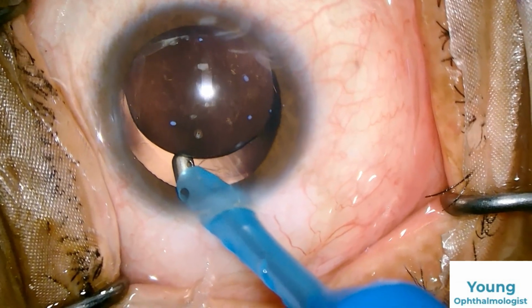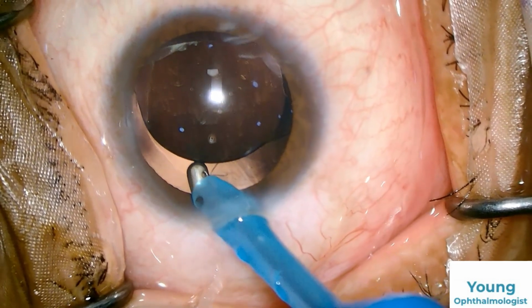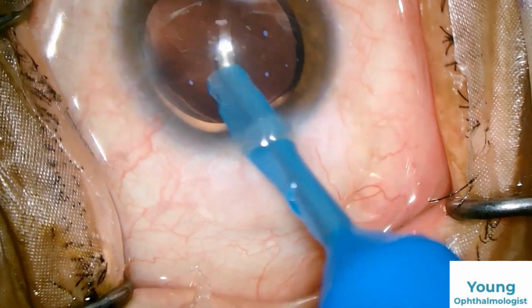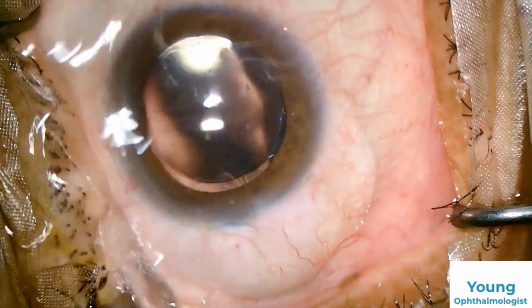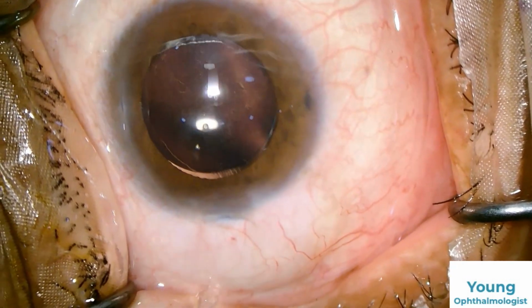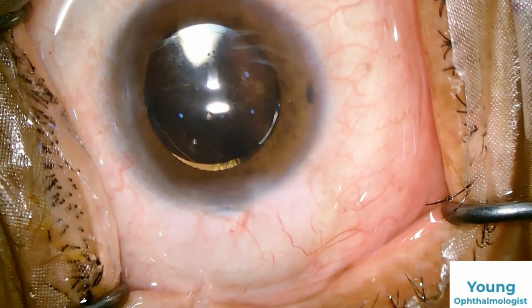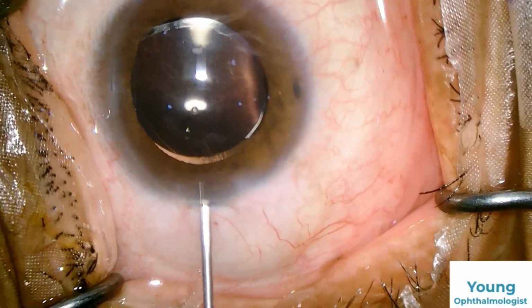The visco wash behind the IOL helps maintain the pressure the next day, and it gives you practice especially for toric lenses, where visco wash behind the IOL is very important to avoid any postoperative rotation. Now it's time to form the chamber.